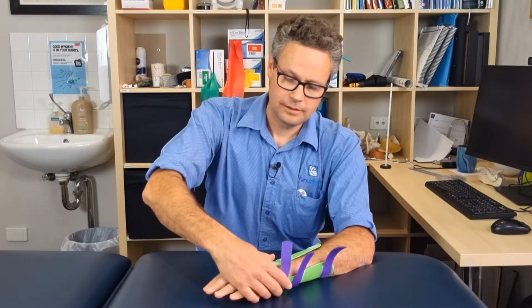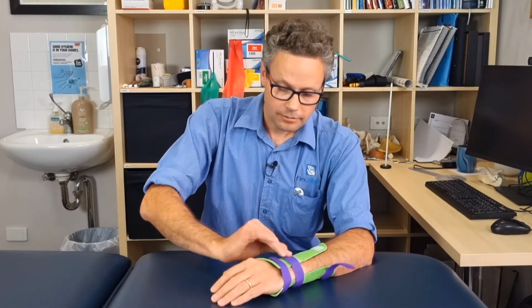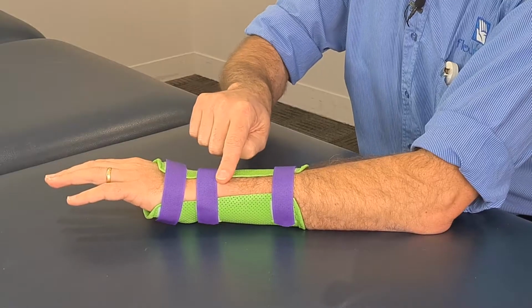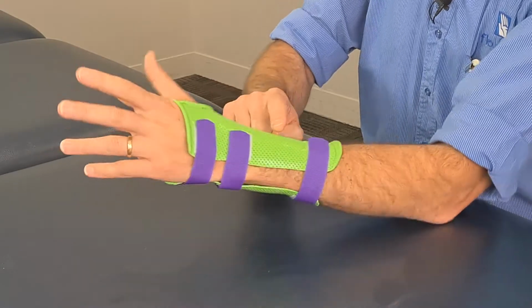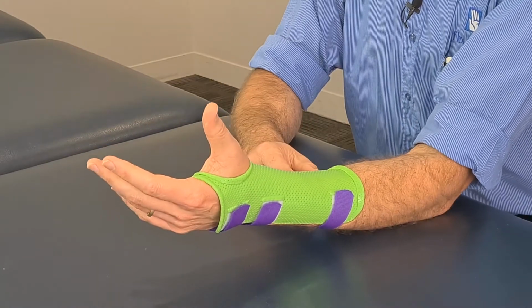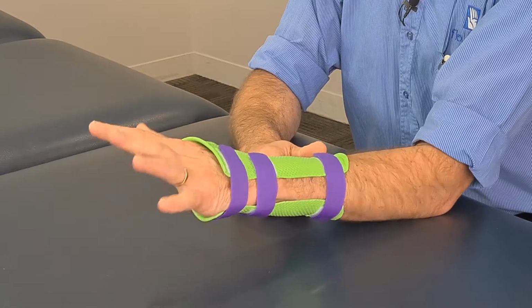Anyone who's wearing a rigid plastic splint up against soft skin could possibly develop pressure areas. They are most likely to happen where there's a bony prominence, like here on the wrist, or where there's lots of movement, like here in the web space of the thumb, or anywhere that joints are moving outside of a splint. The usual first sign of pressure areas is discomfort, and then redness might develop. But please go back to the hand therapist that made the splint and ask for it to be adjusted before you start to get major problems.